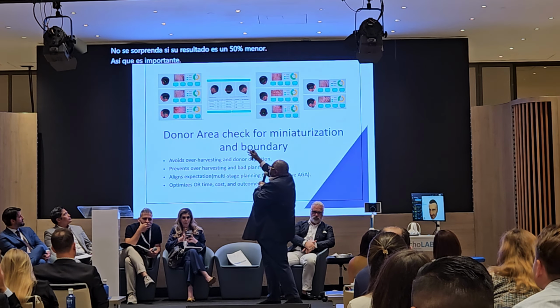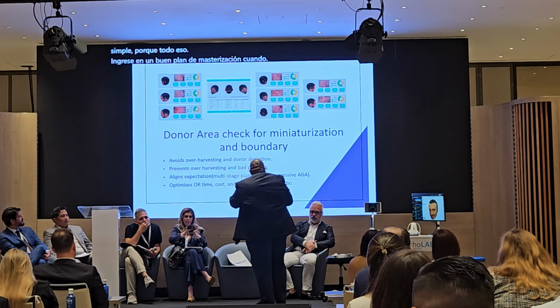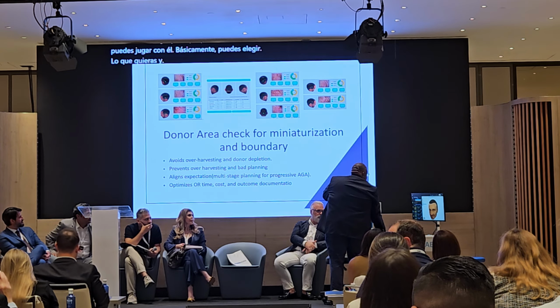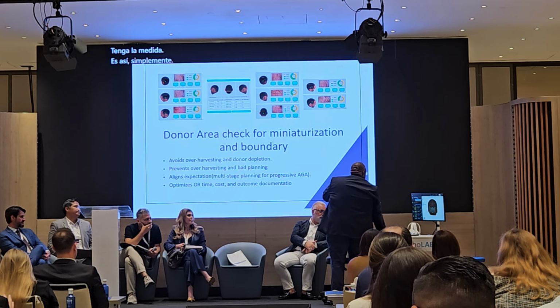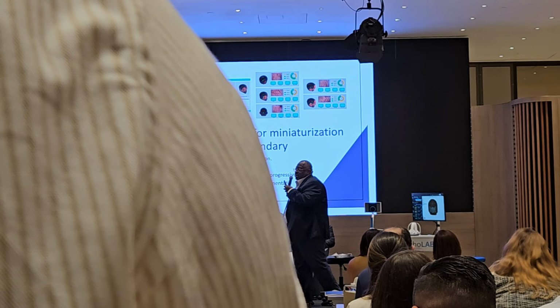So you can have a report like that with a 3D. As I say, you can play with it. You can basically choose whatever you want and have the measurement. You just take the patient, you can rotate the head, you can decide here I want to take the measurement there, and at the end it just gives you a good calculation of everything that you need, and so you can record it.